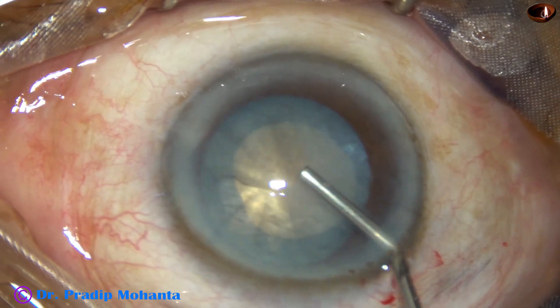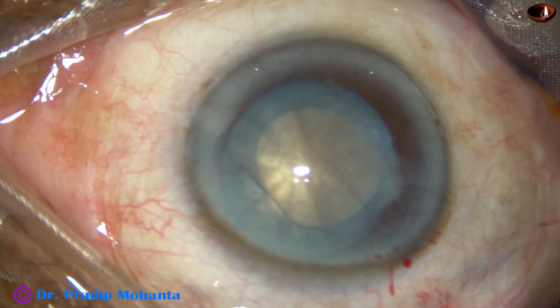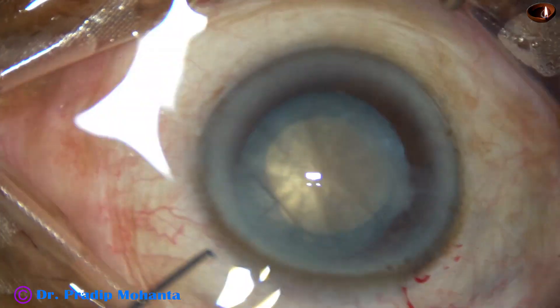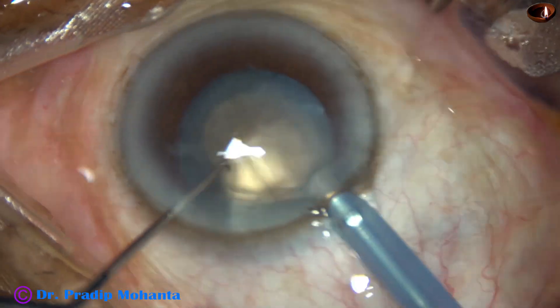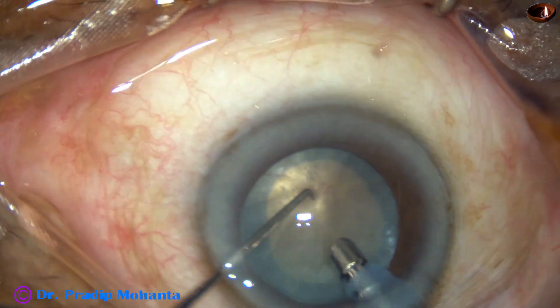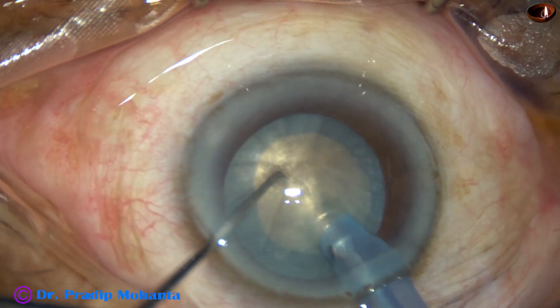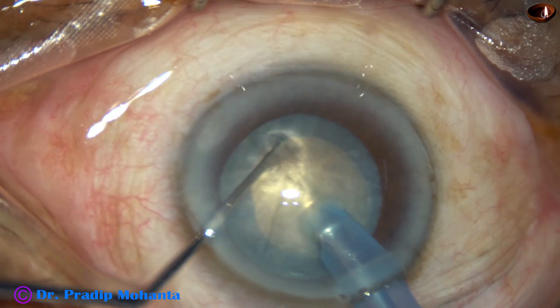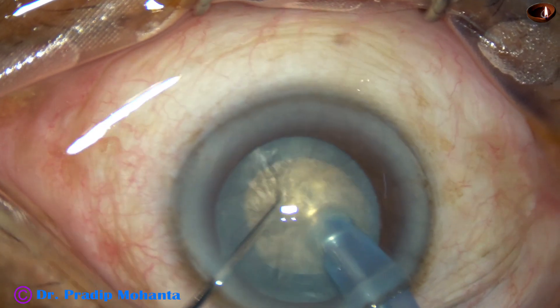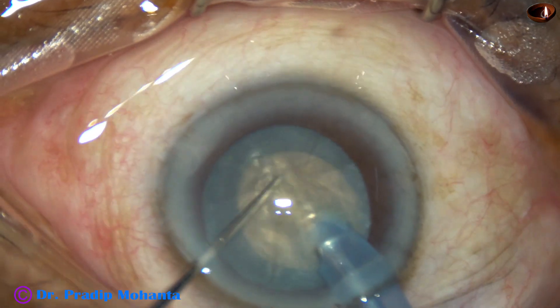I was not sure whether I would be able to manage this nucleus with this size of rhexis. I started with the phaco needle — this is the Faco from Oertly. I made a tunnel and found that the nucleus is very hard.